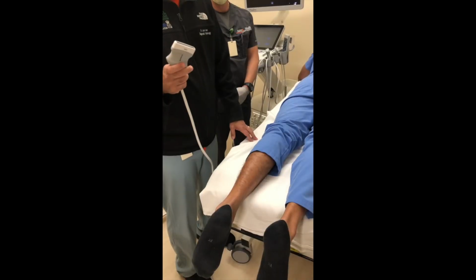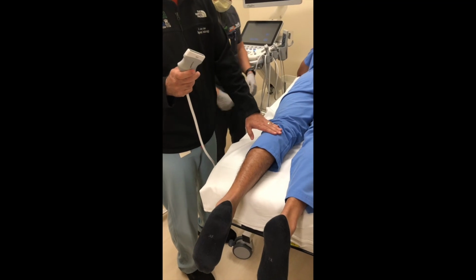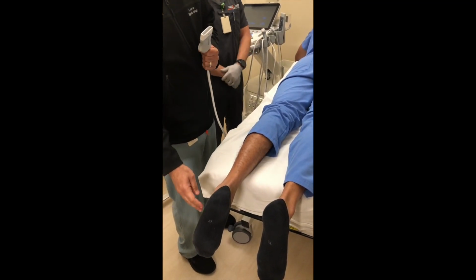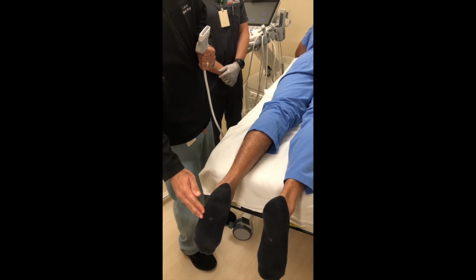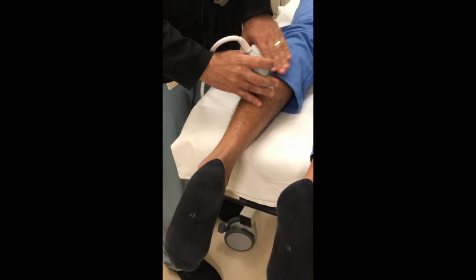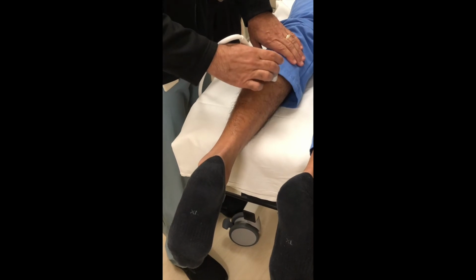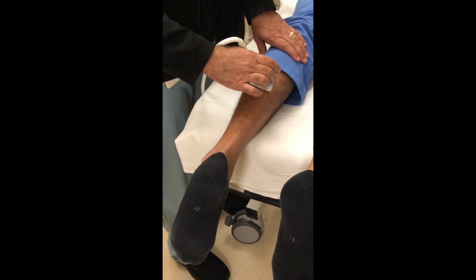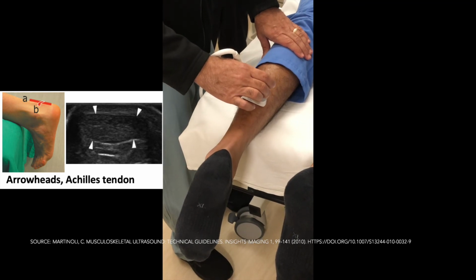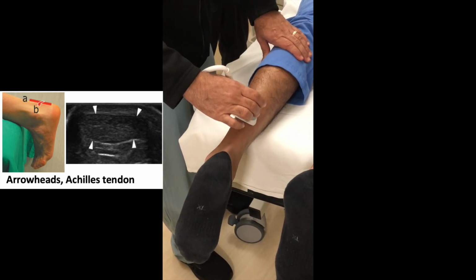Basic ultrasound evaluation of the ankle: place the patient prone with their feet sticking out of the bed in a degree of dorsiflexion. We will use a linear 18 transducer, and we'll begin by interrogating the back of the ankle and the distal calf, starting at the short axis, looking at the medial and lateral heads of the gastrocnemius and the soleus as they unite to become the Achilles tendon.